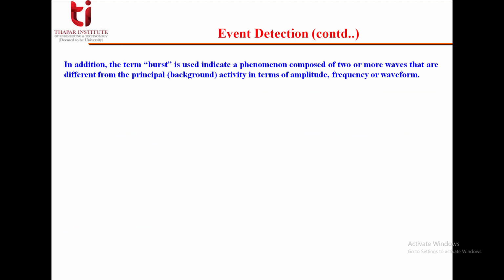In addition, the term burst is used to indicate a phenomenon composed of two or more waves that are different from the principal, or we can say background, activity in terms of amplitude, frequency, or waveform. A burst is abrupt and has a relatively short duration.